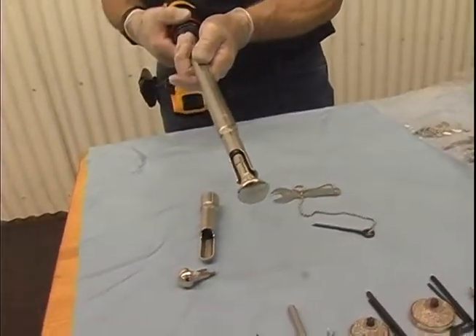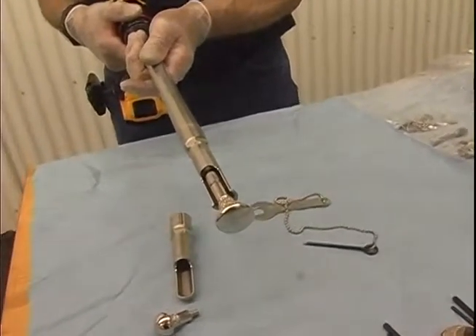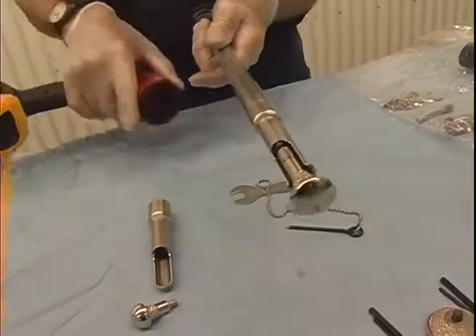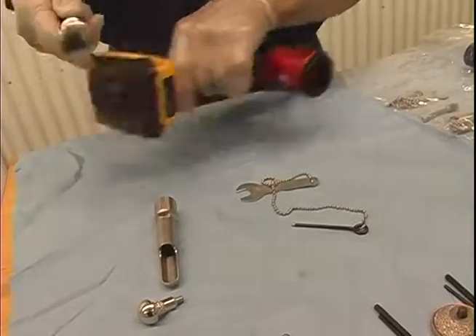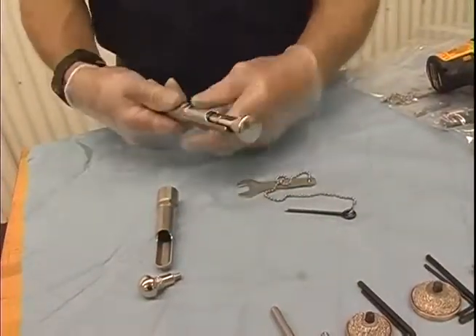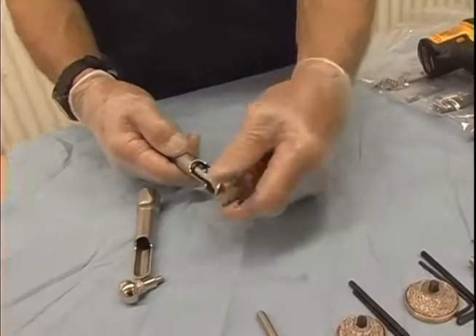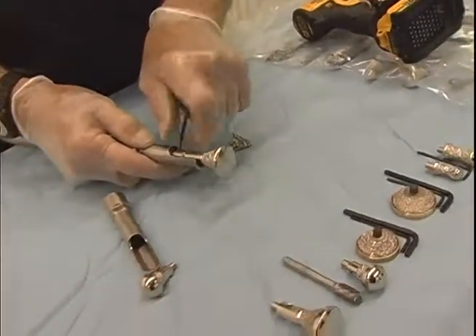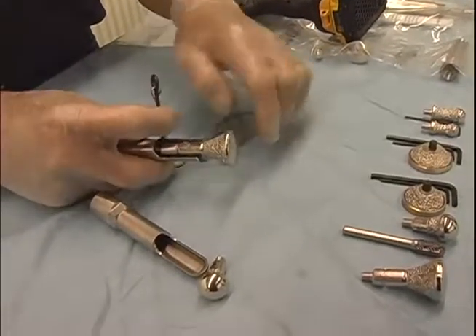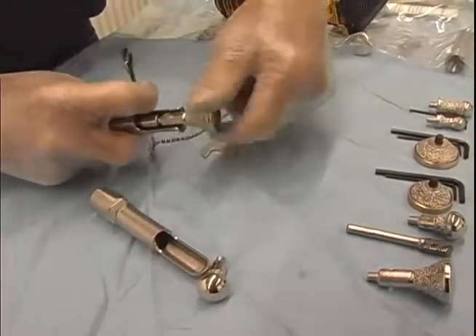This burr is only used on the upper 11. It's at the wrong angle to float off hooks on the lower 11 tooth. Most of the time, this would be the burr that would be left on this shaft until something specialized was going to be done.